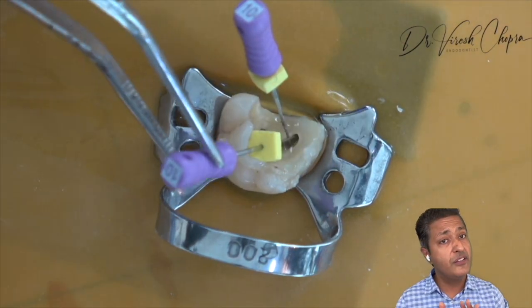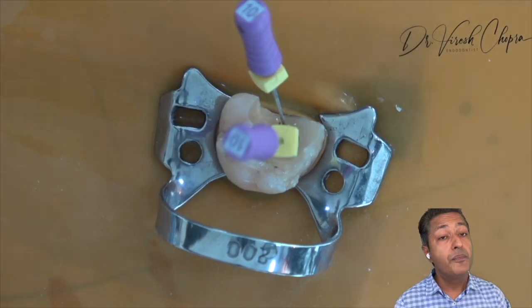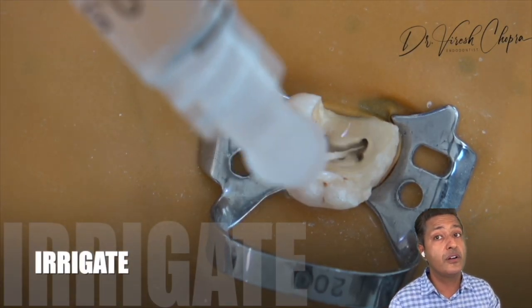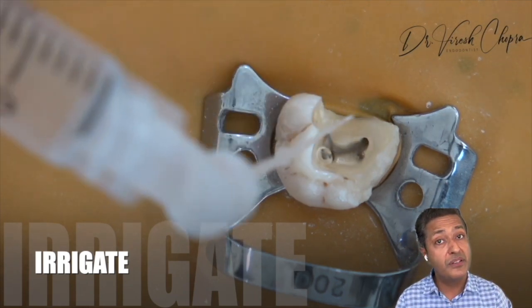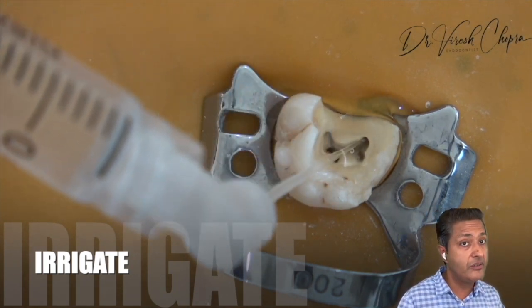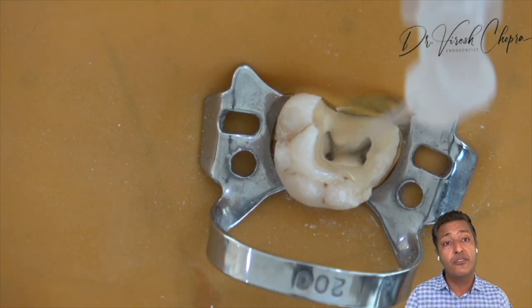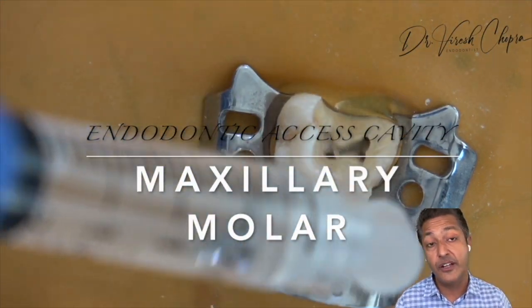We have to be really gentle, and once that extra canal is confirmed, in a similar way, use your Endo Z bur, extend the cavity there. If we are not using endodontic ultrasonics, just extend the cavity, enlarge the orifice with GG drill and irrigate. Kindly do not ignore the irrigation part, because this is the most important part but the most ignored one. We are not able to devote enough time to irrigation, but it can actually do magic if done properly.